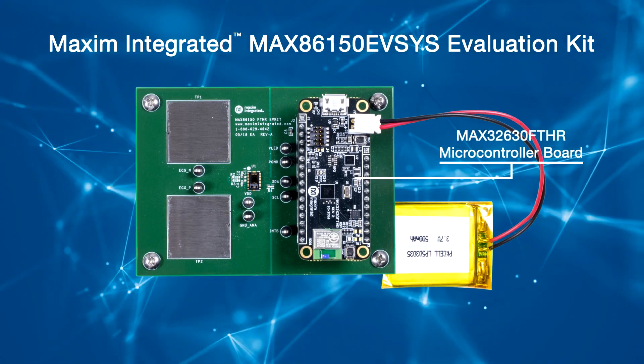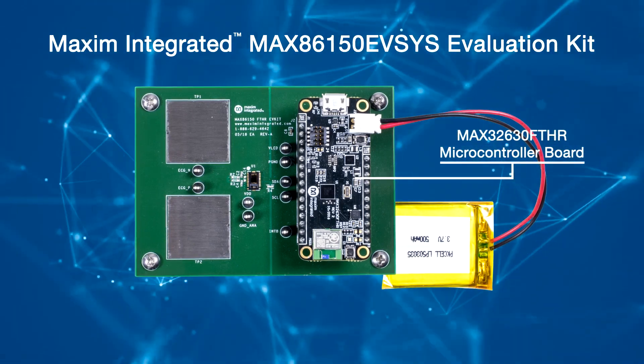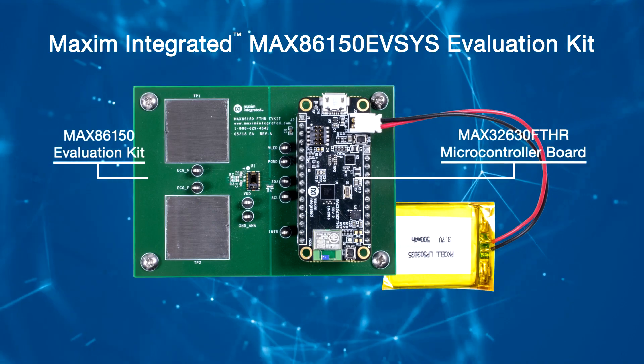The evaluation system consists of two boards that connect through header pins: a MAX32630 Feather microcontroller board and a MAX86150 evaluation kit.